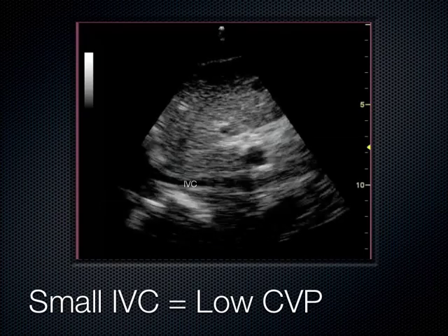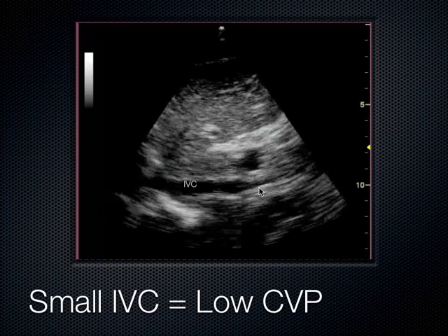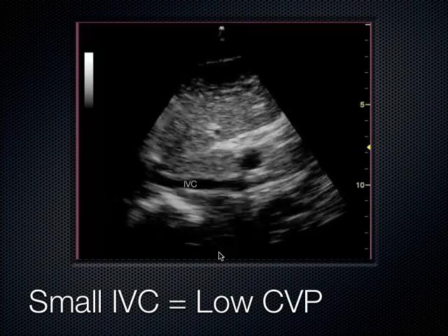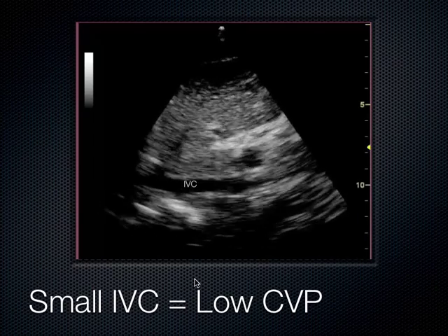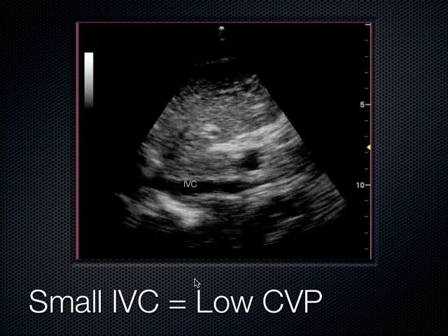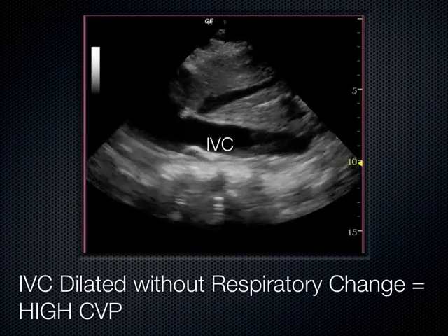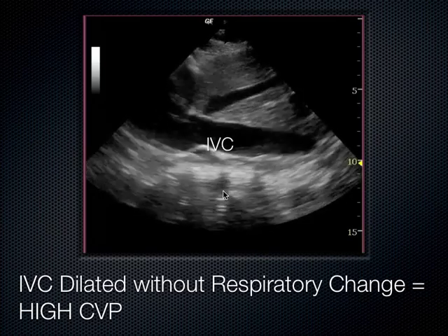Here's one that's a really small IVC that as they breathe in, it collapses down. And we can see this collapsibility going on. As they breathe in, it just completely obliterates. So that's a really low CVP. This is somebody where I'm opening up the IV fluids. Another example here of a dilated IVC, no respiratory change, high central venous pressure.